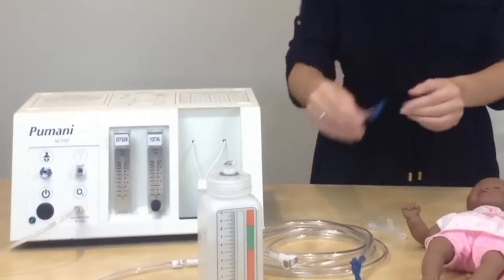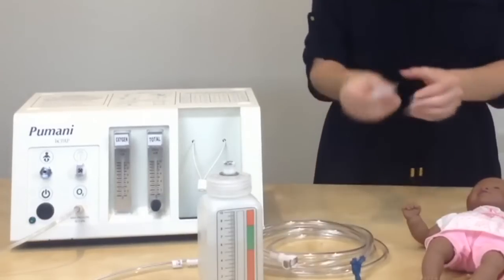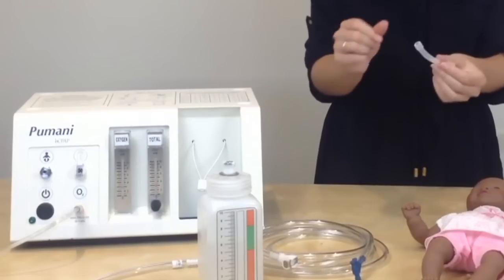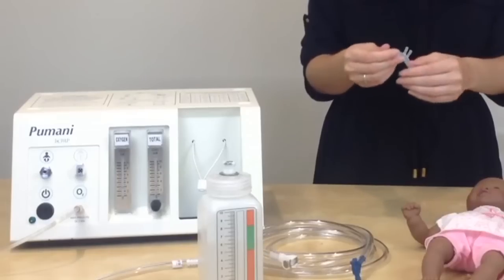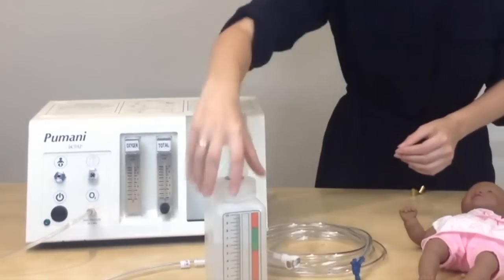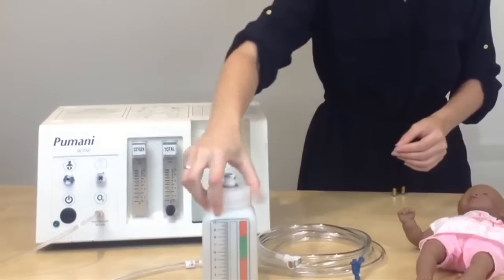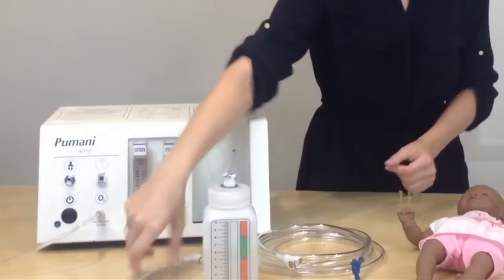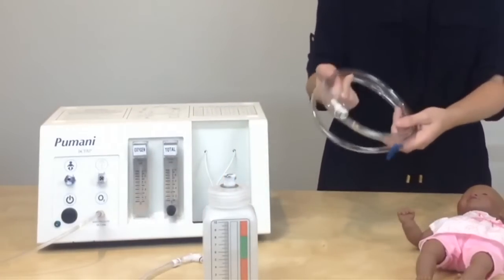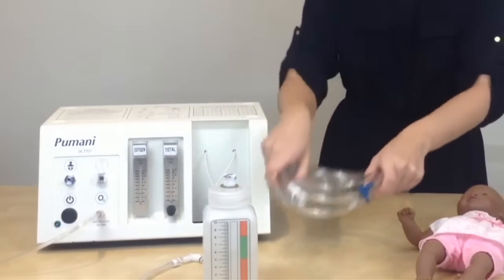The end cap can be cleaned and reused. The prongs are labeled as single use only and are typically used for only one patient; however, you may choose to clean them. You can clean and reuse the bottle and the bottle tubing. The patient tubing is also labeled as single use only; however, you may choose to clean and reuse this as well.